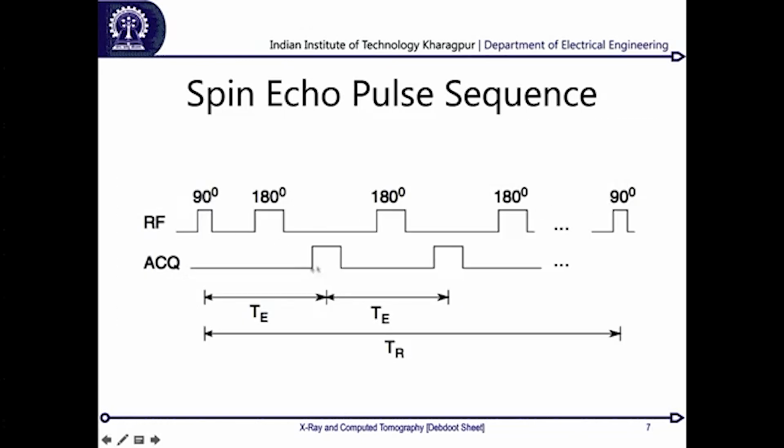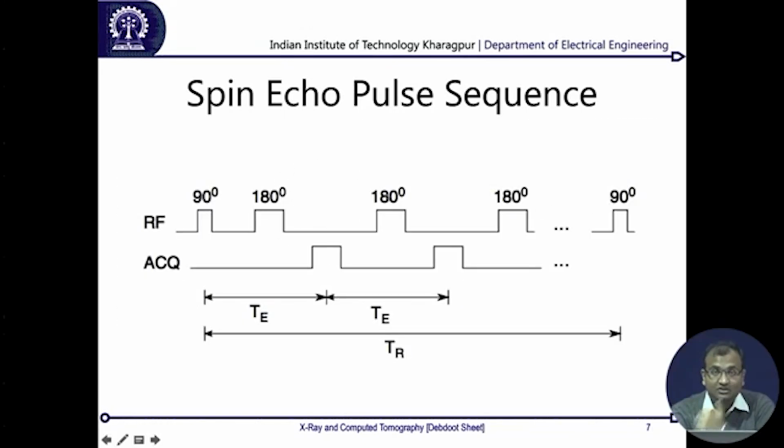So, cumulatively, let us enter into the next explanation, which is how to generate both the T1 and T2. I will have to generate some sort of a pulse repetition rate, and how is this generated? Initially I said that whenever I want to give some energy in order to turn the magnets onto one direction, I have to give energy at the frequency which aligns with the frequency of rotation of those protons. So for that reason we have an RF coil which is going to give it.